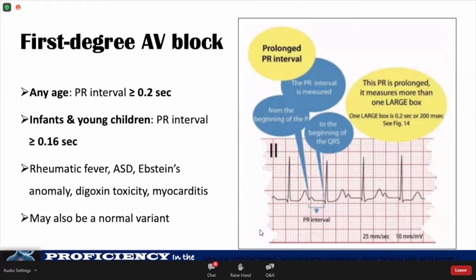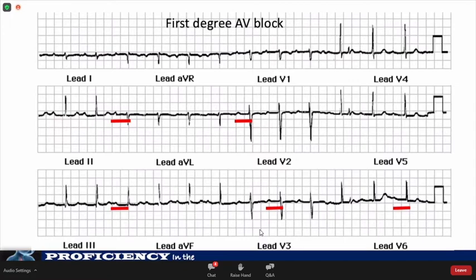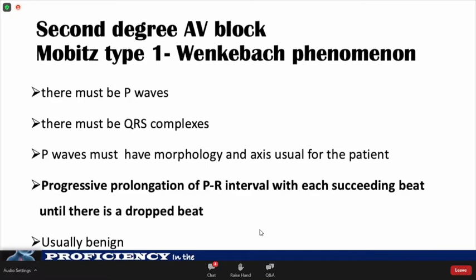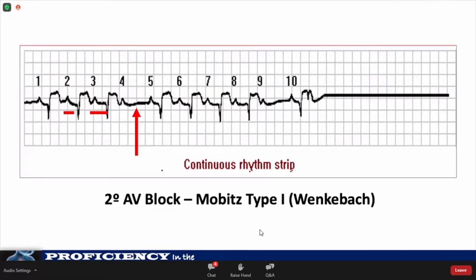Here is an example of first degree AV block. It looks similar to a sinus rhythm, but the PR interval is almost one and a half large boxes long. In second degree AV block, there are two types: Mobitz type 1 (Wenckebach phenomenon) and Mobitz type 2. What makes both second degree heart block is that electricity is periodically blocked in the AV node, resulting in P-waves without a following QRS complex. In Mobitz type 1, there is progressive prolongation of the PR interval until there is a dropped beat. In the example shown, you can see progressive prolongation of the PR interval until there is a skipped beat.